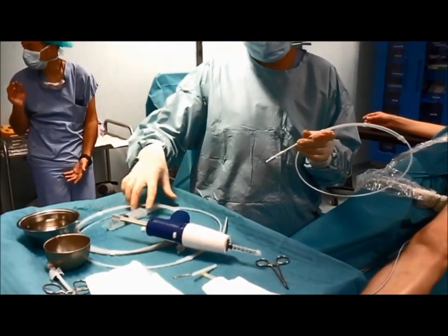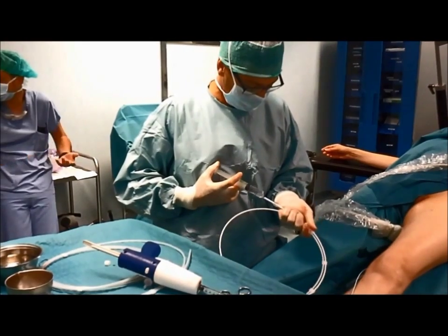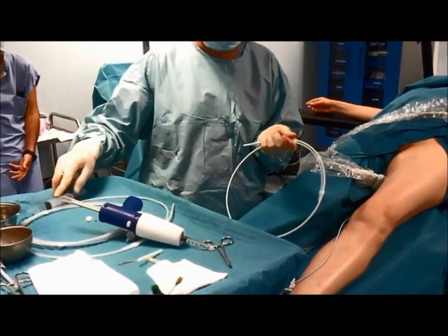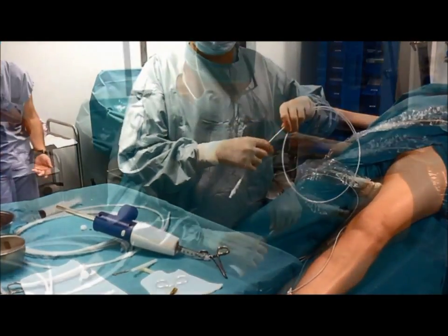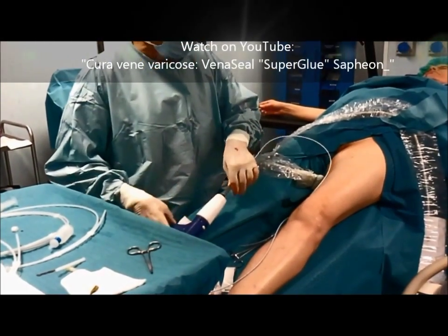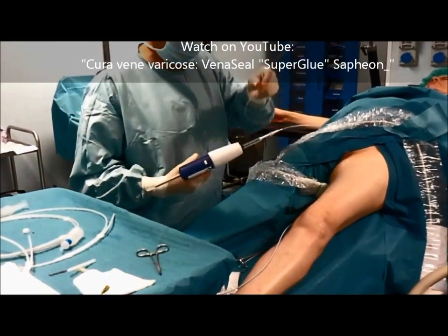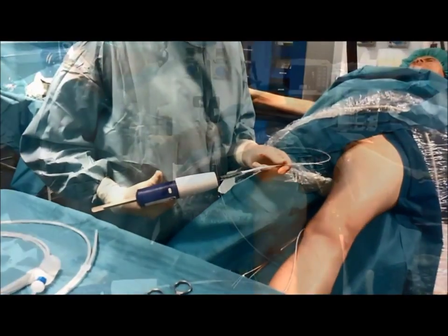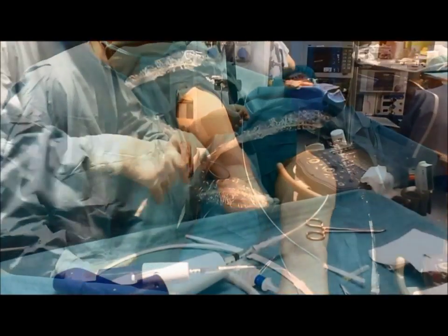The cyanoacrylate glue is loaded into a syringe, and the syringe and the delivery catheter, previously flushed with saline solution, are connected to the dispenser gun. The catheter is then primed by advancing the glue with the gun up to the catheter tip.